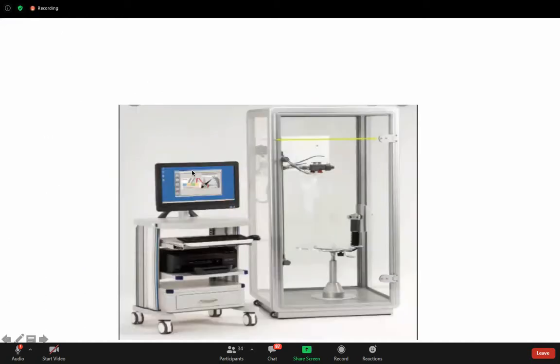Okay. So this is one of the pulmonary function test rooms, and you can always ask the patient to know whether they actually did the PFT or not. Ask them if they've been in this glass box, okay? Because you need to have a control over the volume, okay? A lot of people confuse peak flow and the things you do at the bedside or in the emergency with the full pulmonary function test, which usually happens inside a box.